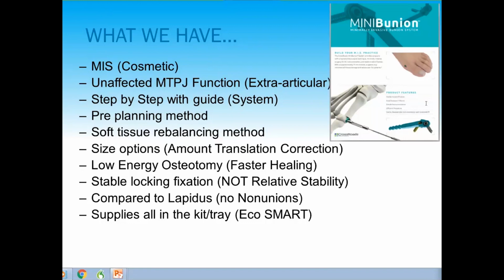One is what I mentioned, where you can have, say, a 3.5 thickness intramedullary mini-bunion implant, 3.5 or 4.5 millimeters. So if you think about the cortex medially is about 2 millimeters thick, and then you add the translation of the thickness of the implant, which is 3.5 millimeters.